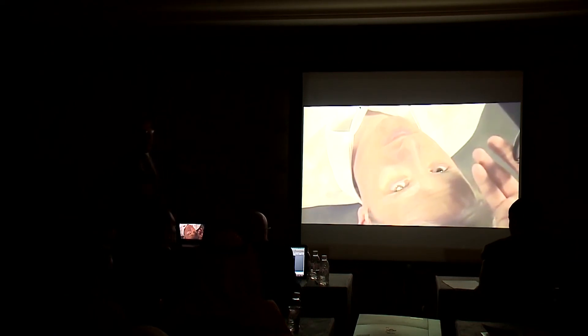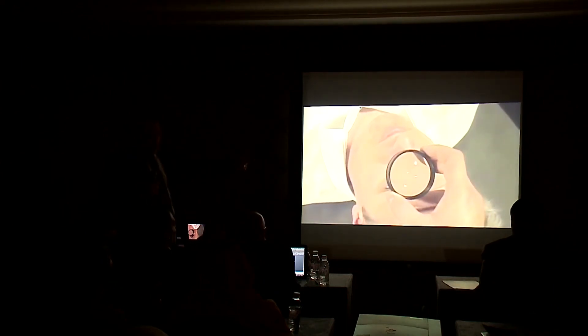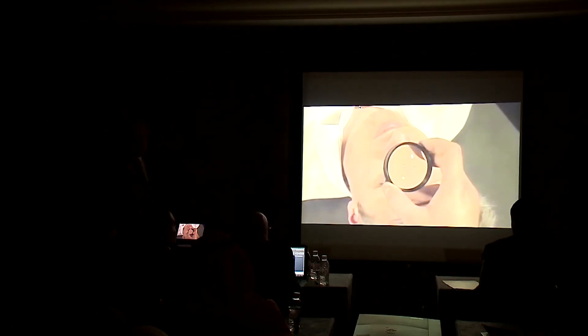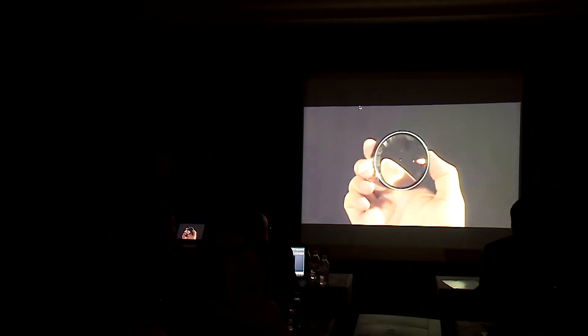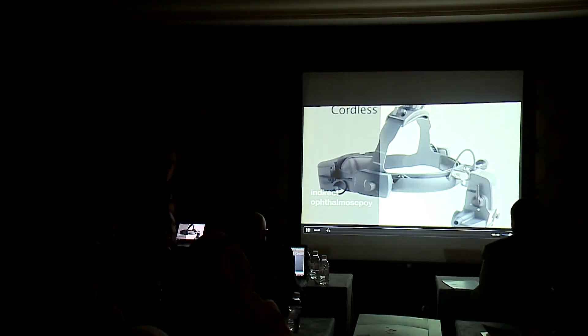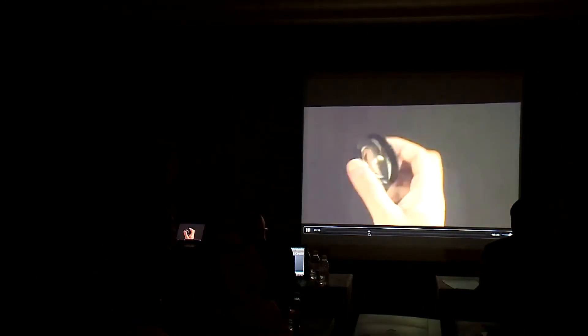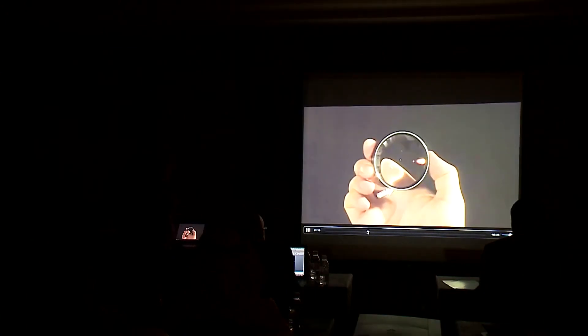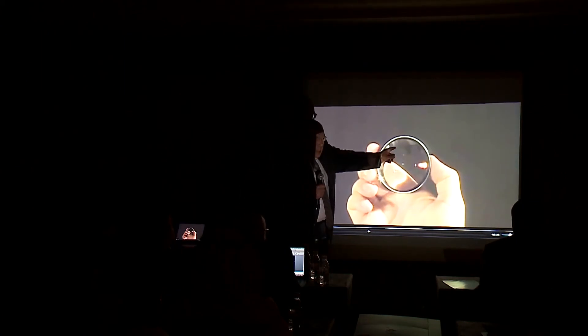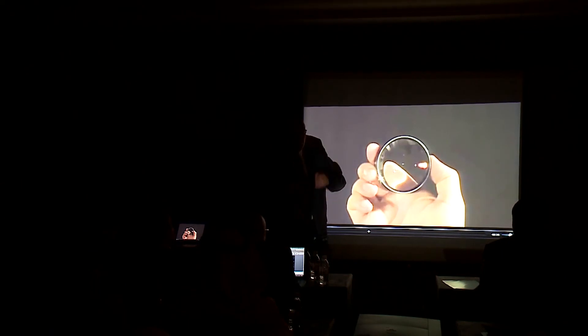And then you direct the light to the pupil. The pupil should be fully dilated and use the beam as equal as to the size of the pupil. The pupil interrupts the light by putting the condensing lens and trying to move the lens forward and backward to get the wider field and clear image. What I just want to let you know, that there is a white line on the condensing lens which denotes which side should be directed to the patient. This white edge of the lens should be to the side of the patient, not to your side.